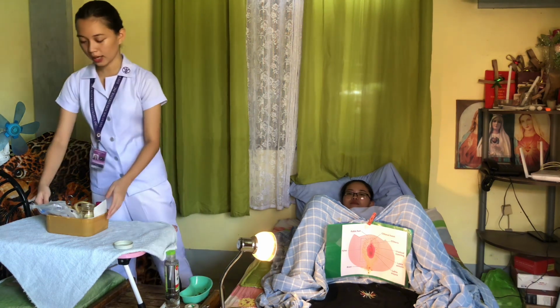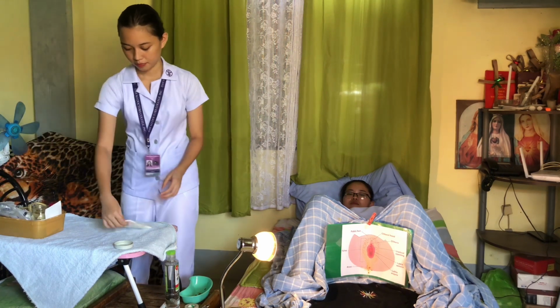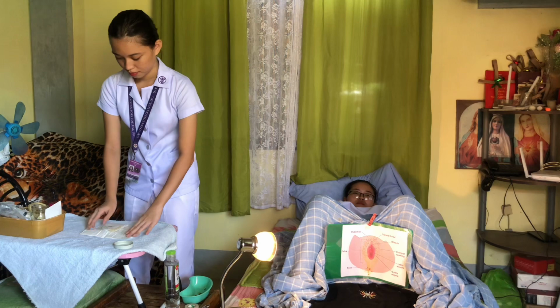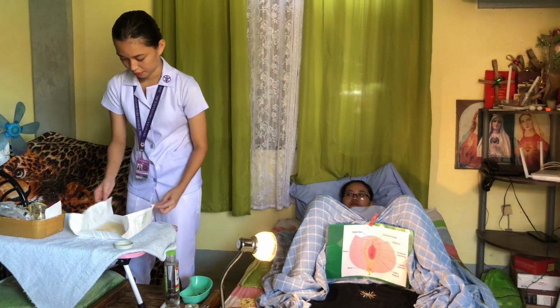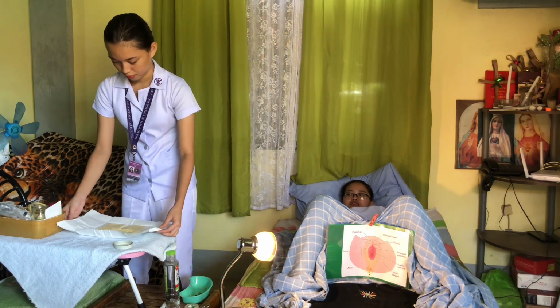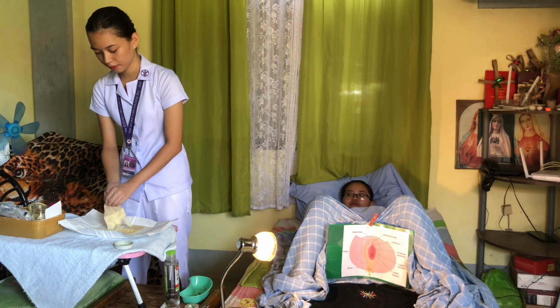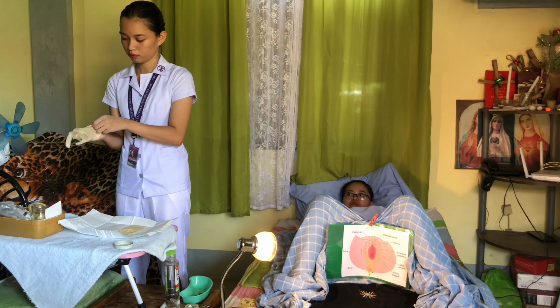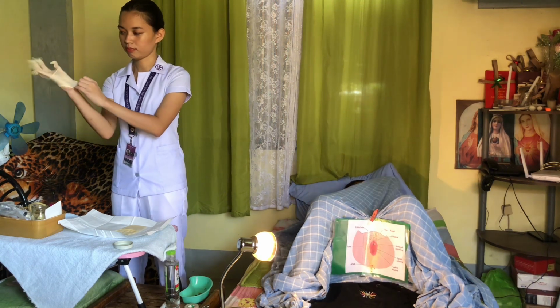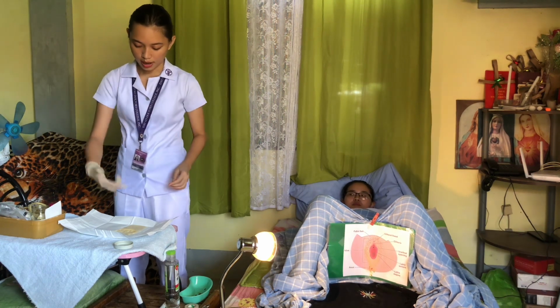After that, I am going to put on the sterile glove. This is to protect ourselves from the client and vice versa. So we're going to glove our dominant hand first, and on the other.